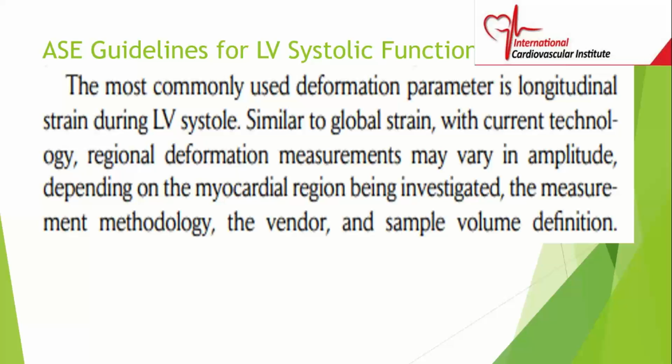We have a global strain where we look at the diastolic longitudinal length, and then we subtract from that the systolic longitudinal length, and we divide it by the diastolic longitudinal length, and that's going to give us an overall global longitudinal strain. We can also do regional deformation measurements, and that allows us to look at just a segment to see if it's normal or abnormal.